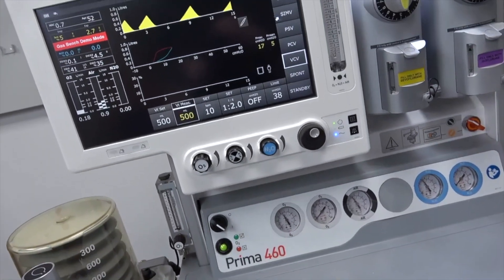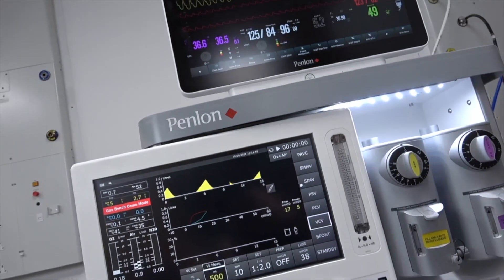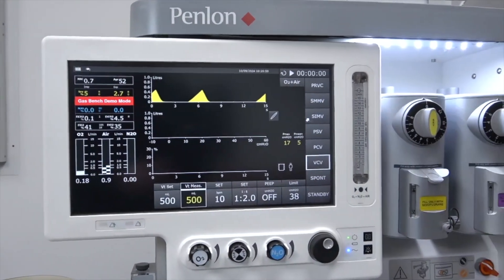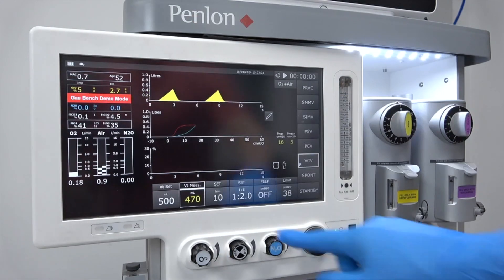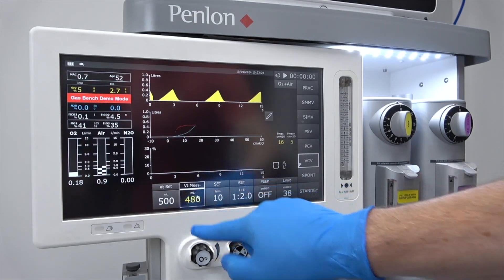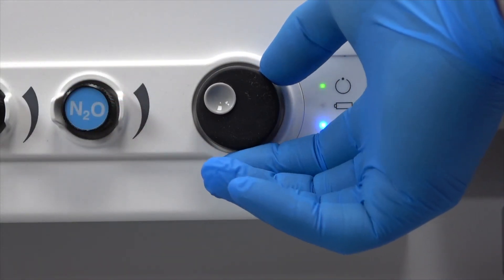The latest development of the Prima 460 is the 15.6-inch colour screen with up to three waveforms and respiratory loops to give the anaesthetist the clearest information. Ventilator control is by touchscreen and navigator wheel, and the screen design is simple and easy to use.